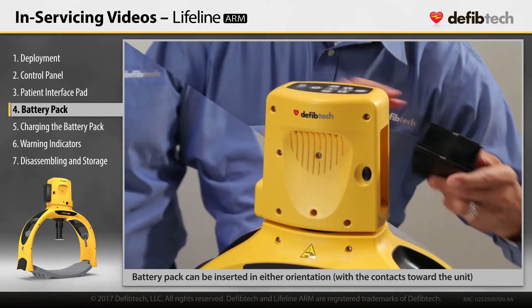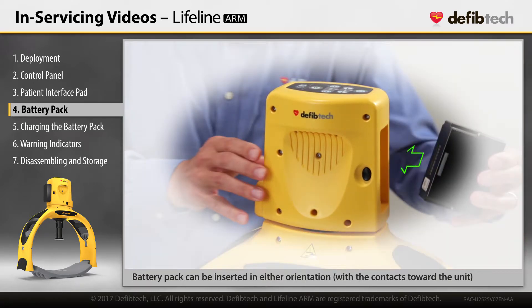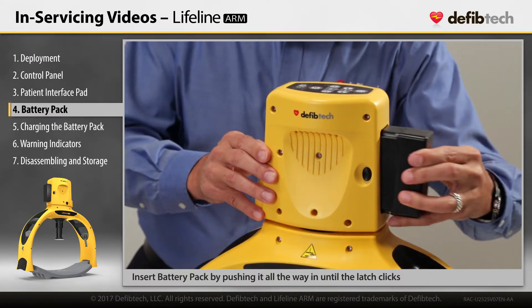The battery pack may be inserted in either orientation as long as the battery pack contacts are toward the device. Push it in all the way until the latch clicks.